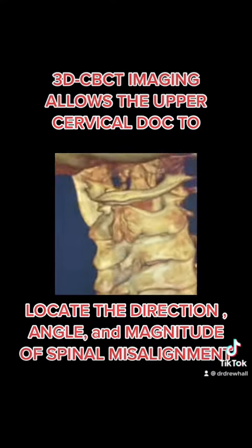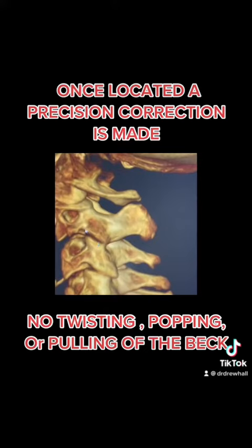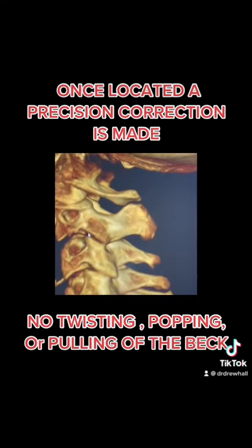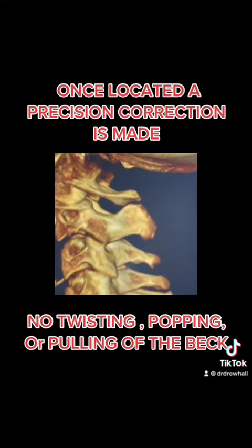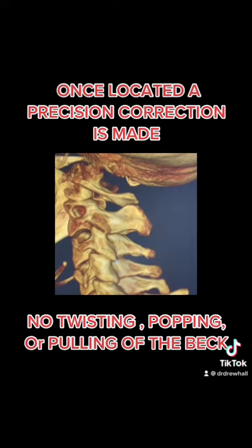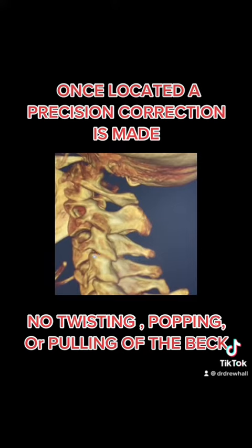So that's the left joint. When we turn around and look at the other side, we can see the left side of the C2 joint, and you can see you do not have the backward displacement on the back of the joint here. However, you do have a little bit of forward displacement of the axis joint on the third cervical, and then when you look a little bit lower, you can see the third cervical joint is massively cliffhanging off the fourth cervical, and the front of the third cervical joint is also backwards.